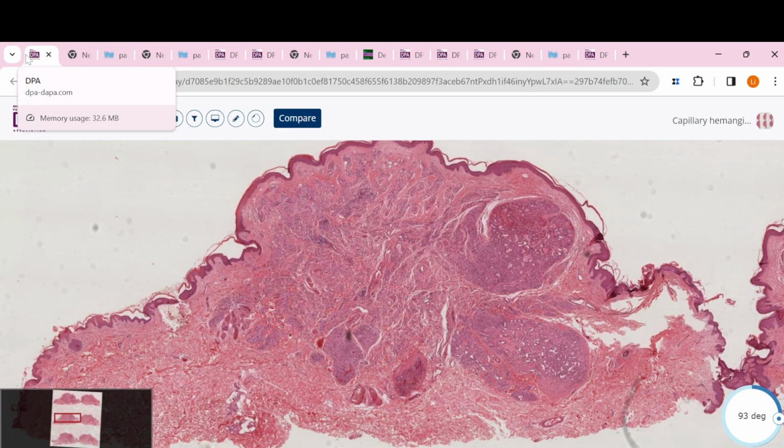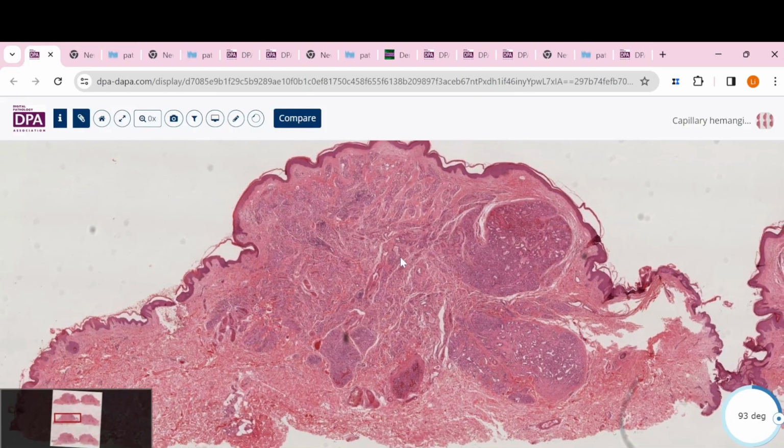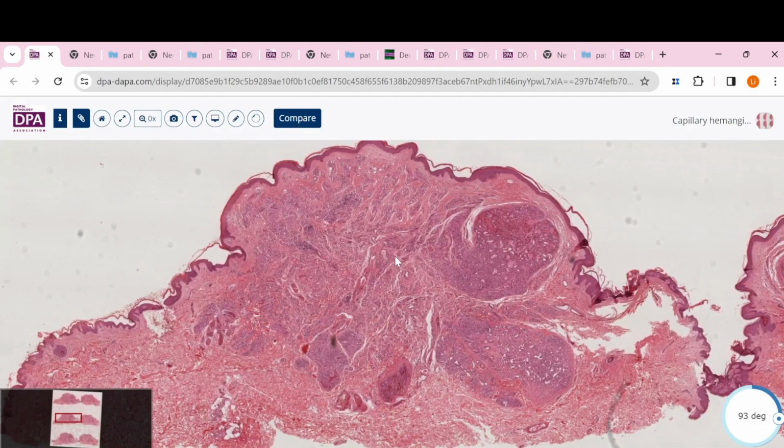And then this is another differential diagnosis. That is capillary hemangioma. For me, I don't think this is really a mimicker or will confuse you about the stasis changes. But it seems in the book they put it there, so I still put it here. We all know this is a dome shape, maybe a nodule, because the epidermis, I mean the skin, just looks something like a punched-out nodule. I don't think with stasis dermatitis you will see any punched-out nodule like this.